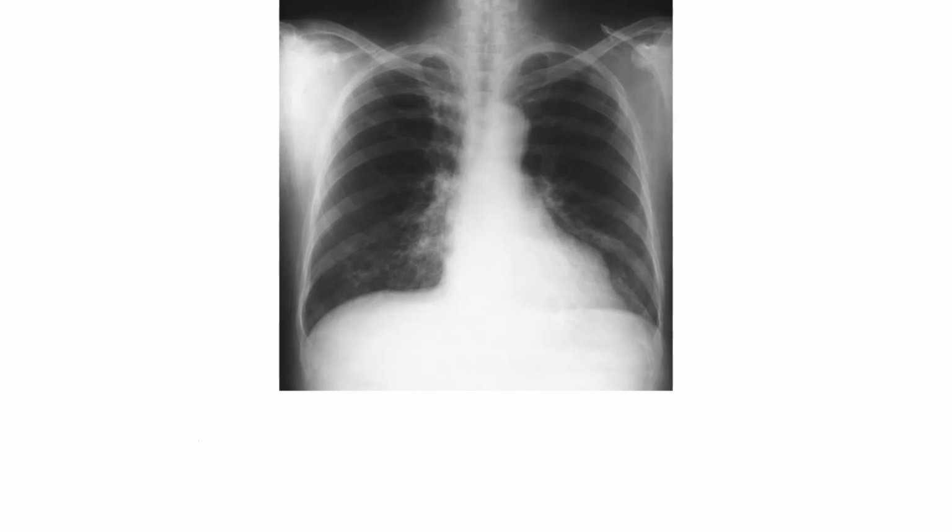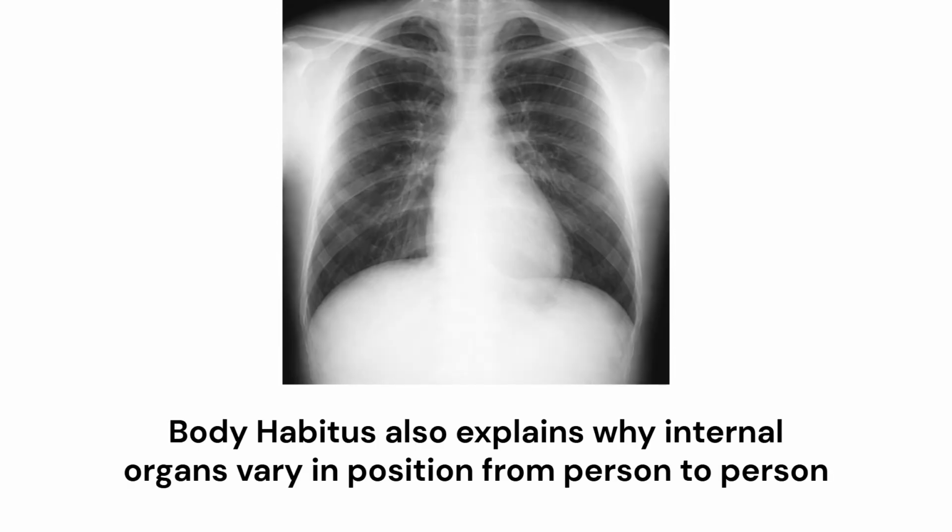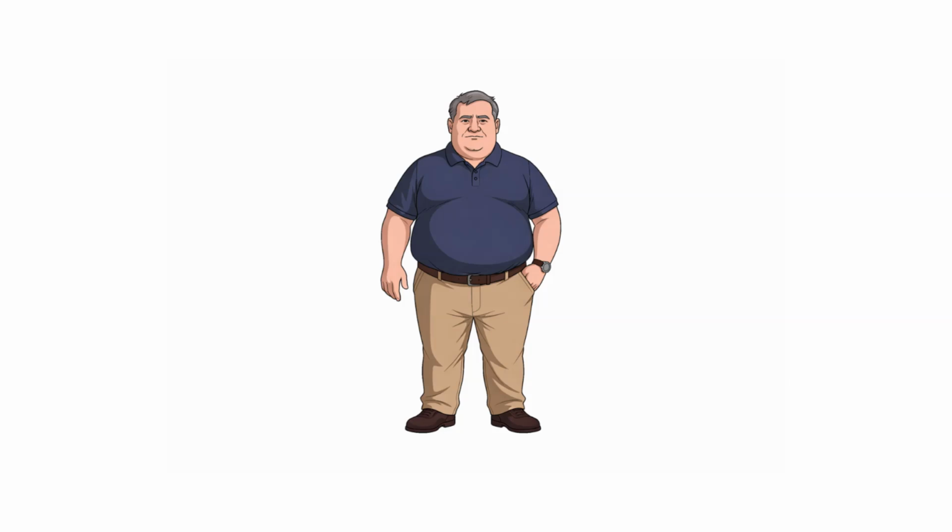Understanding body habitus helps prevent misinterpretation by reminding us that normal anatomical appearance is not identical in every patient. In clinical imaging, recognizing body habitus is part of recognizing normal variation. To make this easier to understand, let's talk about the body habitus of an adult healthy person.